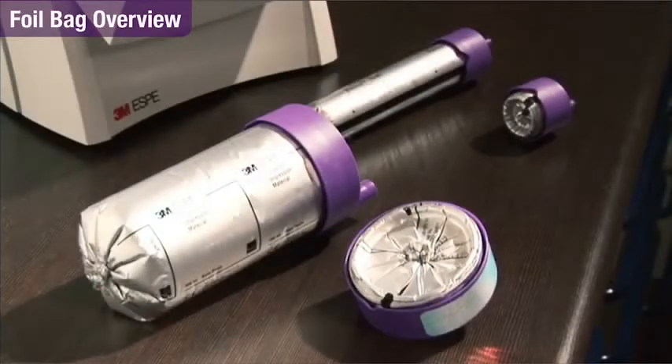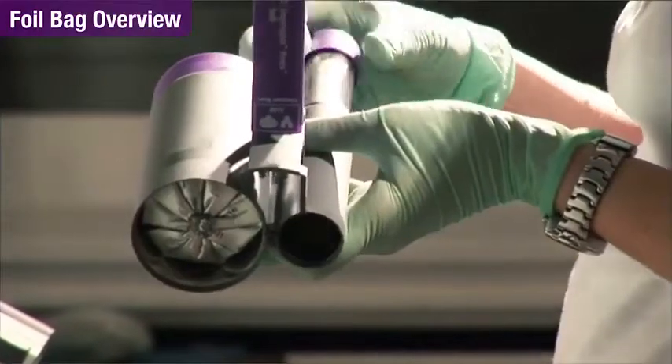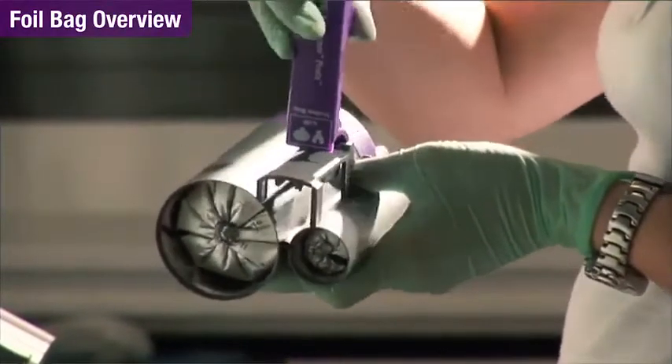Foil bag packaging helps ensure optimum shelf life of the impression materials. Insert the bags from the front into the cartridge. The locating lugs make sure the bags are in the right position. It closes with a clearly audible click.